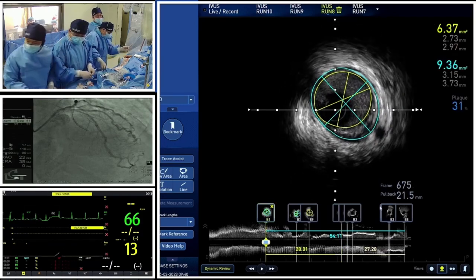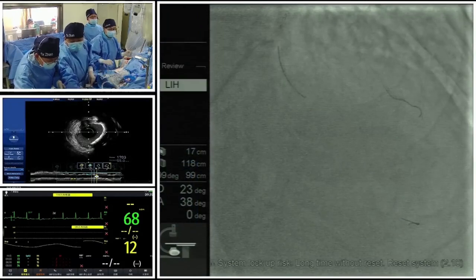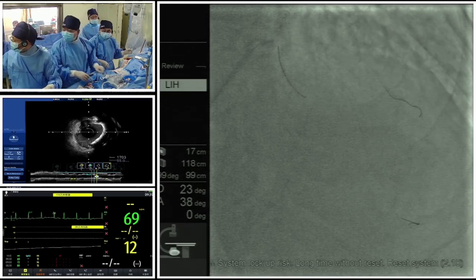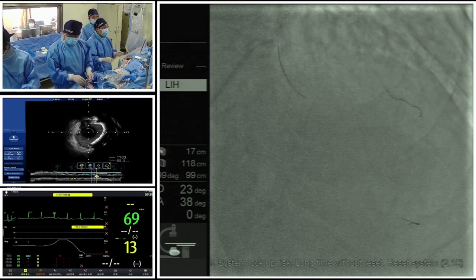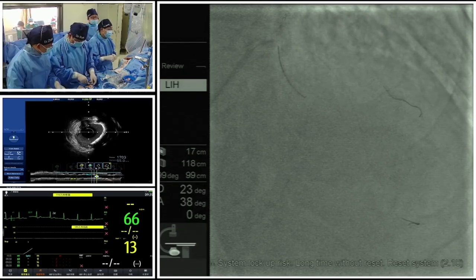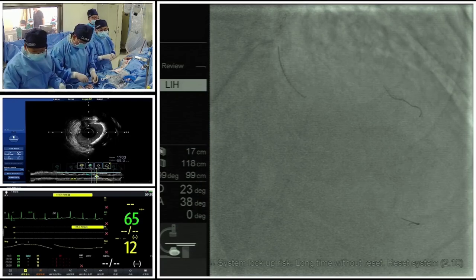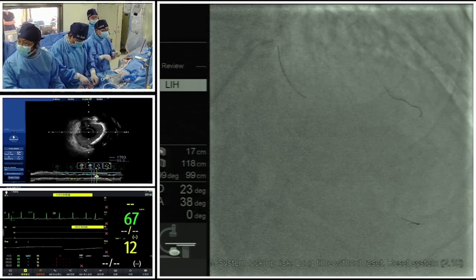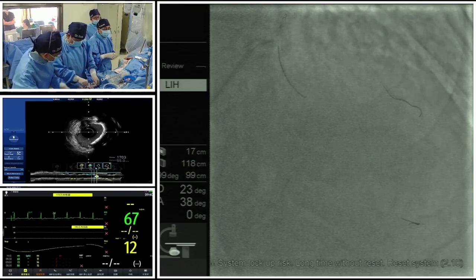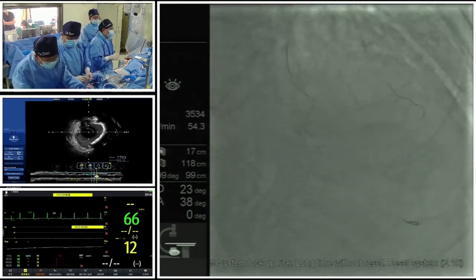As we know, after we mention the IVL balloon, pretreatment is very important for the whole procedure of the IVL. Another key point is the delivery of the balloon for significant stenosis lesions. Sometimes the balloon cannot be delivered across the lesion, and at this time, predilation with a semi-compliant balloon is necessary.